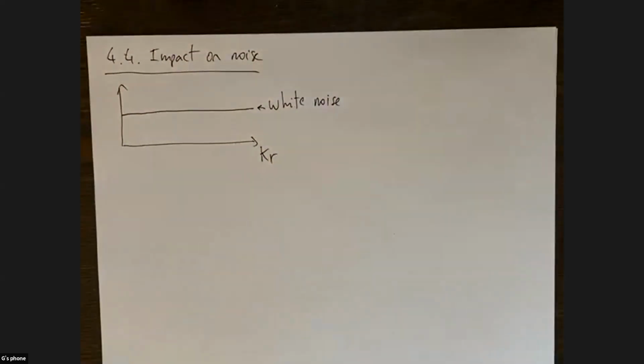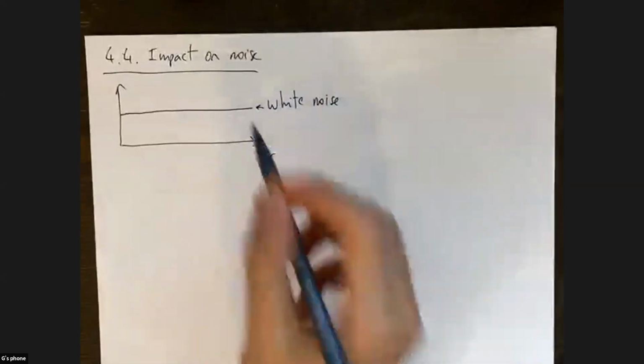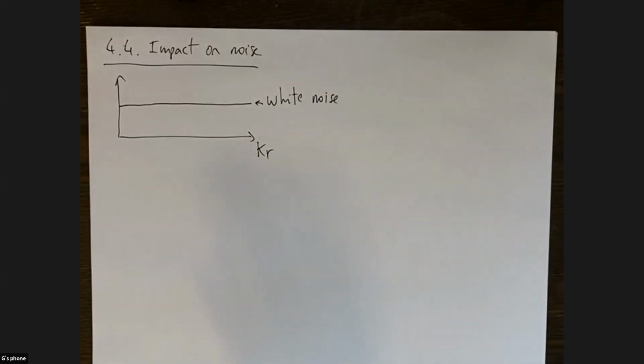Okay, so the noise is, you have low frequency noise, medium frequency noise, and high frequency noise. The signal, however, is coming out of a camera which has limited spatial resolution, so the camera can only capture details of the image or details of the distribution up to a certain level of detail, right? It can capture the low frequencies, but it's going to struggle to capture the high frequencies. And this is also something that's mentioned in the lecture notes.